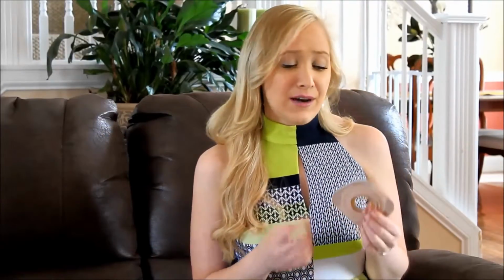I highly recommend cutting your own flanges. They told me, wait a few weeks after surgery before you start getting the company to pre-cut them for you. But I've had my surgery done for almost a year now, and I still pre-cut mine. I feel like my body changes, the way my stoma is positioned on me kind of changes from day to day. I don't know, maybe if I gain or lose weight. So I still pre-cut mine. If you're bound and determined to get yours already cut when they come to you, I would wait 6 months after surgery before I started doing that.